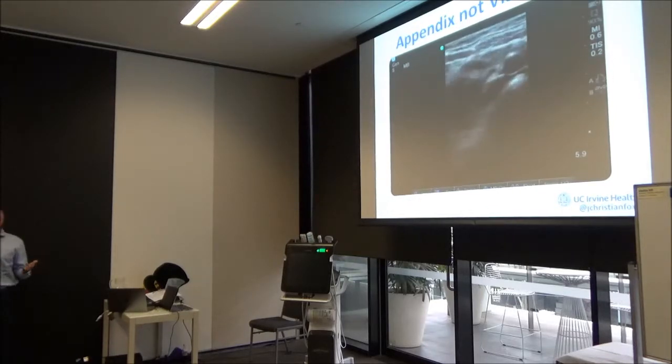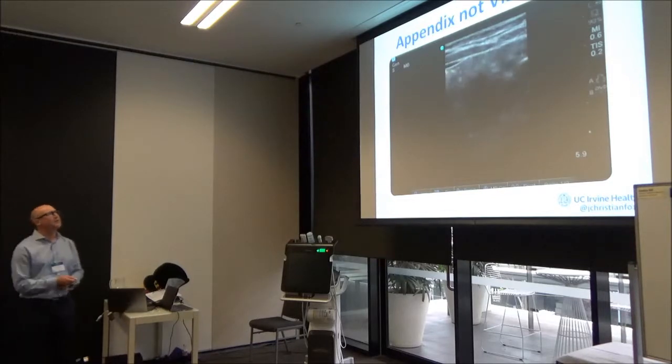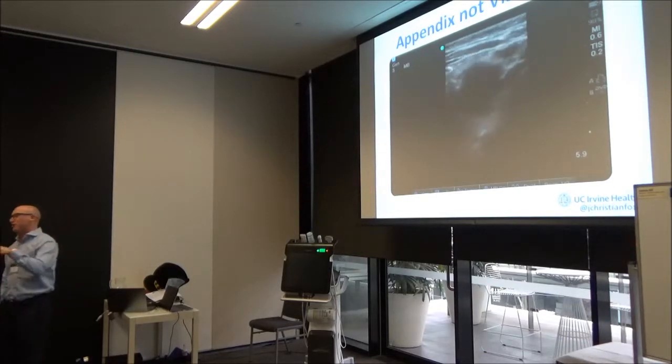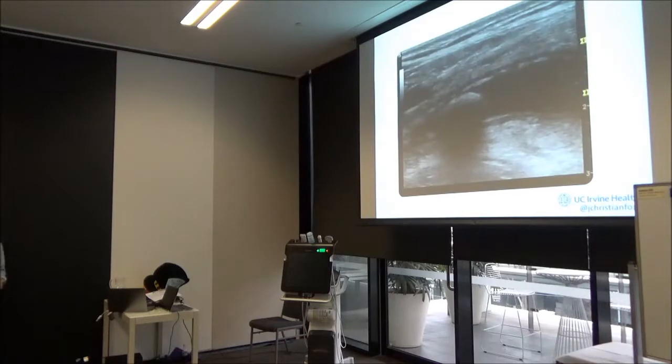There could be something else going on. If it's female, I'm definitely going to consider an endocavitary ultrasound. Look at the adnexa. But this is the idea. You're compressing loops of bowel as you're marching around in that right lower quadrant. I hand the transducer to the patient. I say, put the probe where the most pain is. And they put it like right over their appendix sometimes. They show me the diagnosis sometimes.